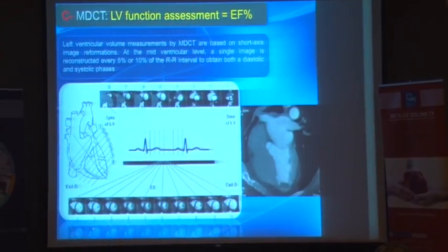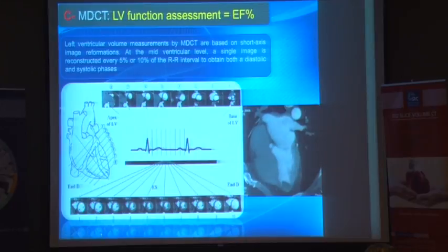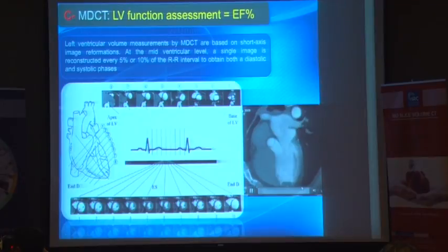And lastly, the last portion of our examination, after the calcium scoring and after injecting contrast, is a functional examination that we can perform, and we can get this type of amazing images. We can see the heart contracting, and even if there is a complication like this thrombus present in the apex of the heart, we can nicely see. And we can also comment on the contractility of the heart and look for any dyskinesia, hypokinesia. Any wall motion abnormality can nicely be seen.